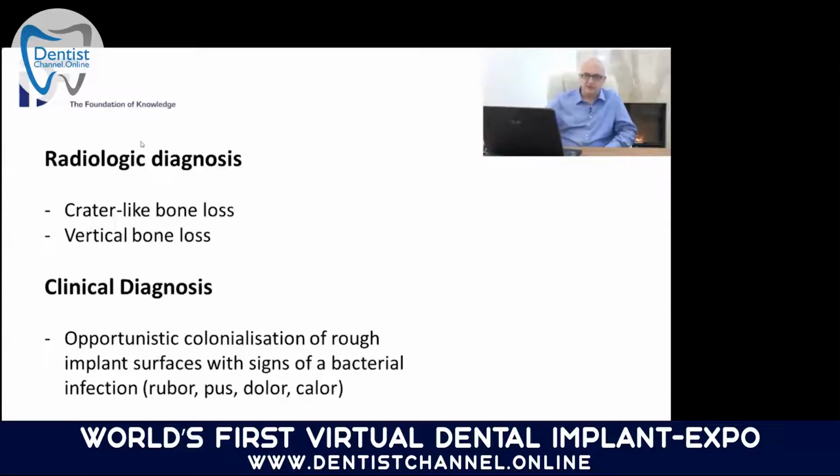So radiologically, we can see around the implant crater-like bone loss or vertical bone loss. Usually it's the crater-like bone loss which is associated to periimplantitis. So the bone kind of recedes away from the implant, and we get like a V-shaped bone loss, and inside this V, inside this crater, we find infected soft tissue.